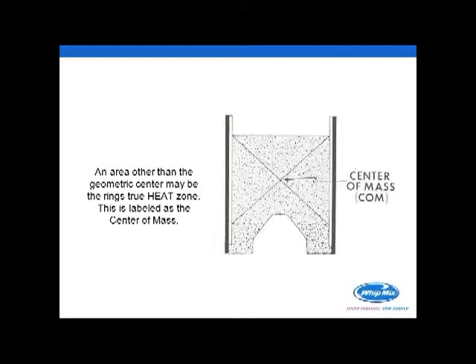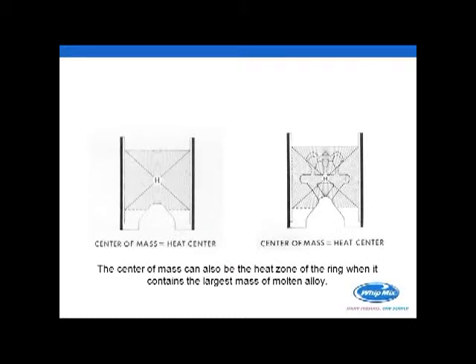Now, if we talk about placement, we place our rings and our patterns appropriately inside that center of mass so that the heat is controlled. And we control what happens with the temperature in there and its application to our patterns or our casting that's just been made. Here's a good example of one on the right-hand side that has been centered properly with a runner bar, sufficient alloy, everything is squared away the right way.